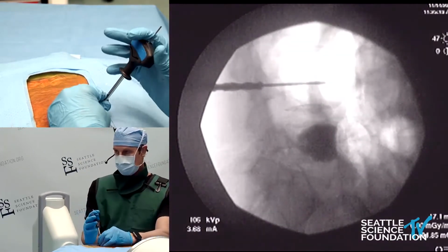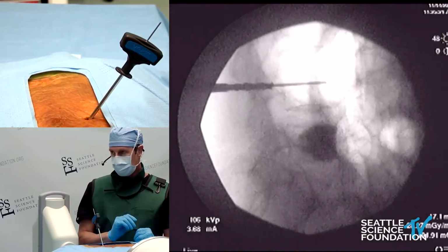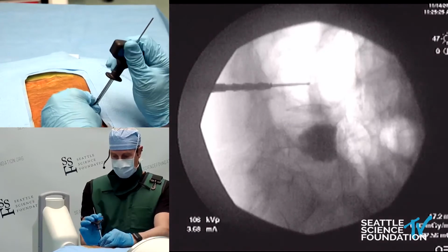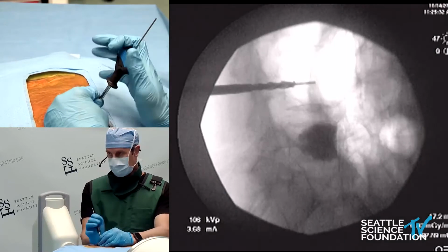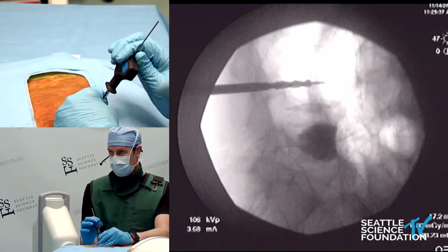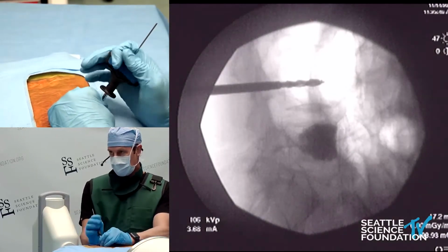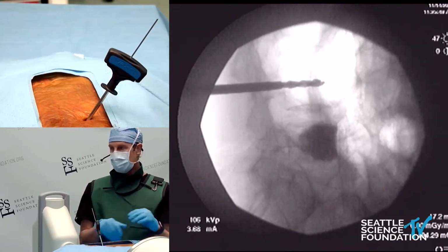So we'll just drill this in, and this is very aggressive. I'll pull the K-wire back a little bit, just to make sure we don't send it forward through the cortex. And we will place it all the way in the anterior portion of the vertebral body. And all of these are size matched. The distal tip of the reamer is sized to exactly the size of the spine jack. And that will be the final resting position of this side of the jack.